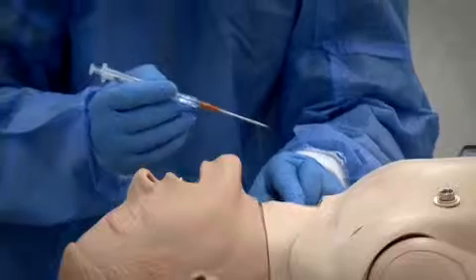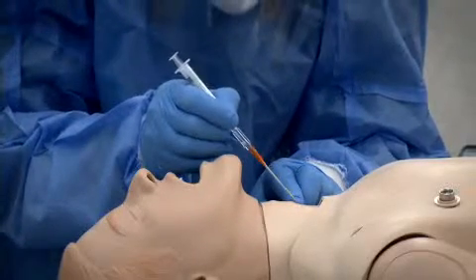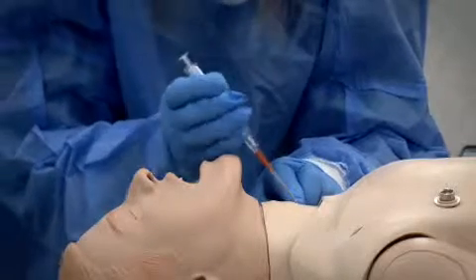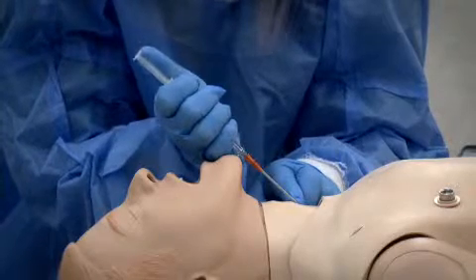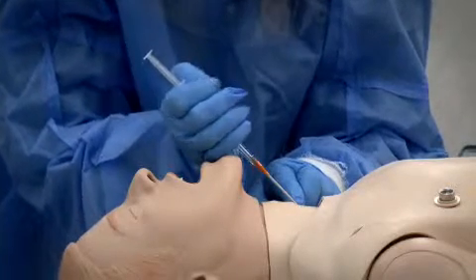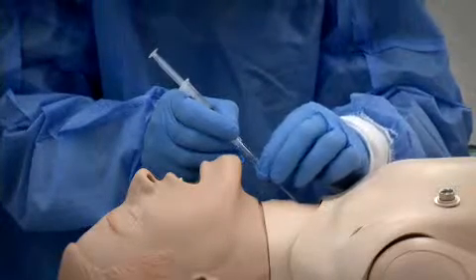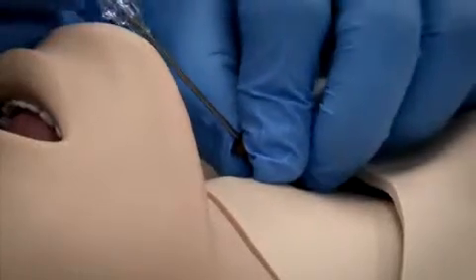Once you feel the membrane has been penetrated, aspirate for free air using the 3 cc syringe. If the plunger releases freely, the tip of the needle is in the trachea. Advance the catheter off the needle and into the trachea while holding the needle and syringe steady without advancing or retracting. Once the hub of the catheter is seated against the skin, withdraw the needle and syringe and dispose safely.